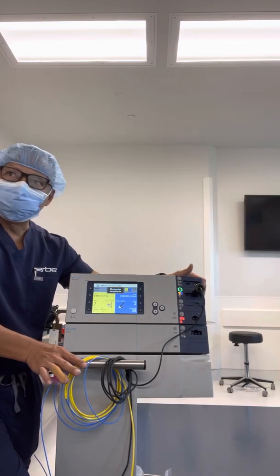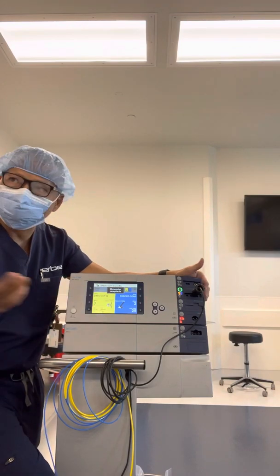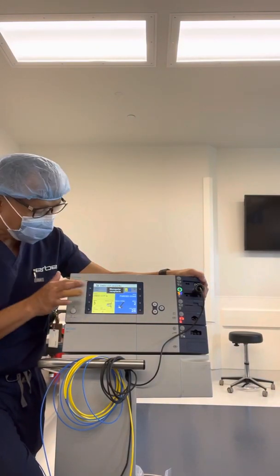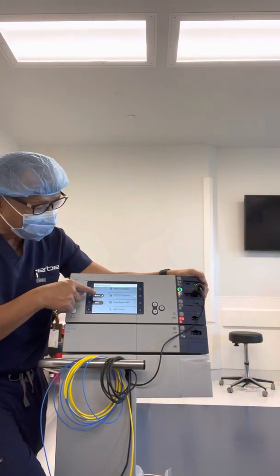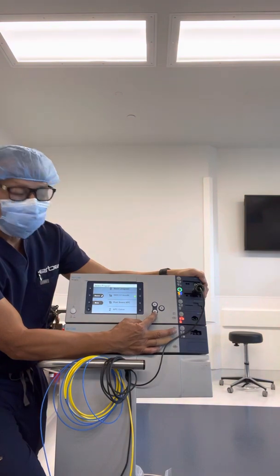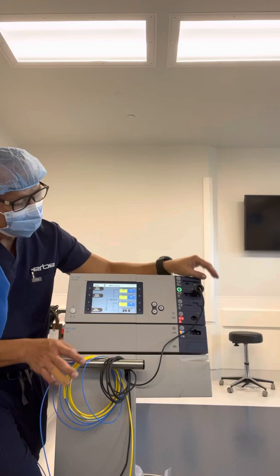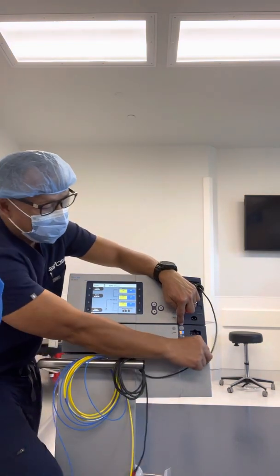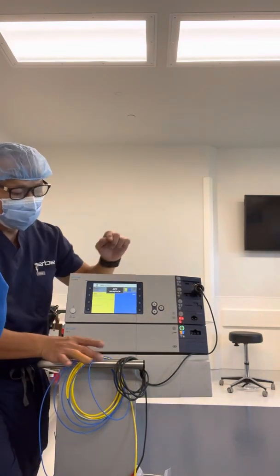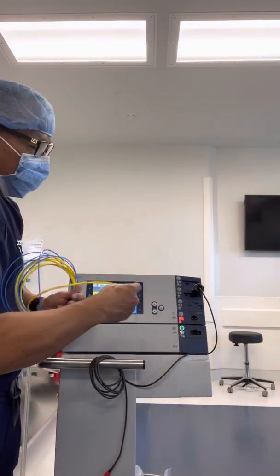He's done with the polypectomy — we call it polypectomy, removing the polyp. He wants to use APC now. Two steps again: guide program, select program, puts you back to the main screen. Scroll up and down — the button is right here. Let's say he's in the colon, so select APC colon. Step two: engage APC. The foot pedal drops down — see how smart it is. Touch the doorbell button to engage.